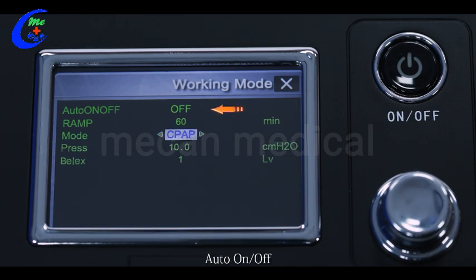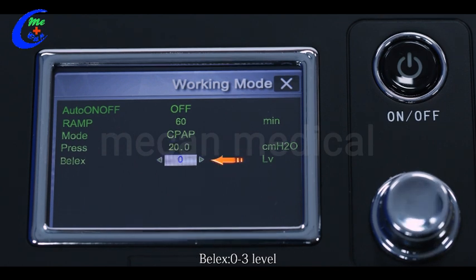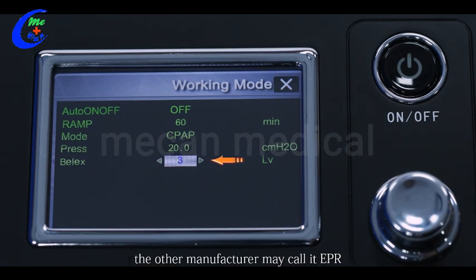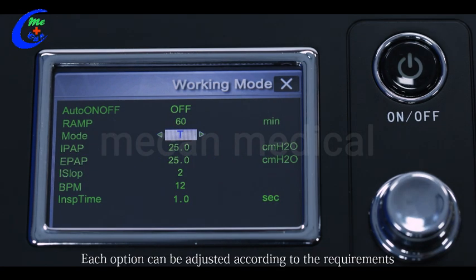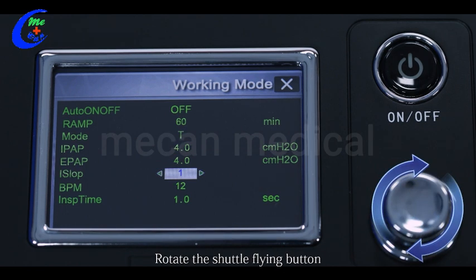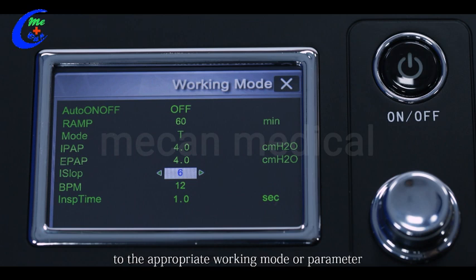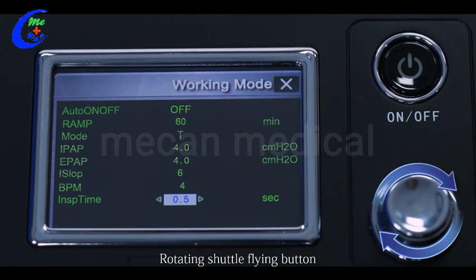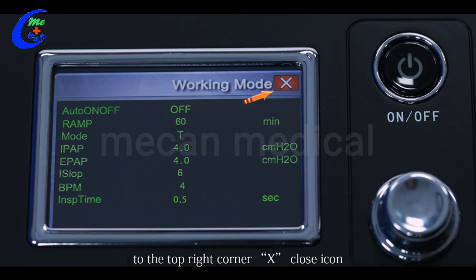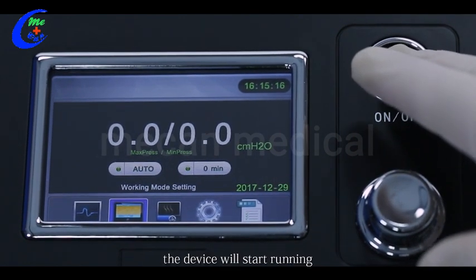In CPAP mode you can see: Auto on/off; Ramp 0 to 60 minutes; Mode CPAP; Setting pressure 4 to 20 cmH2O; and Flex (EPR) 0 to 3 level. Each option can be adjusted as follows: rotate the shuttle dial to the parameter to be adjusted, press the shuttle dial when highlighted, rotate to select the appropriate mode or parameter value, then press the shuttle dial again to confirm. Rotate to the top-right corner X close icon and press to return to the main interface. After parameters are set, press the on/off button — the device will start running.